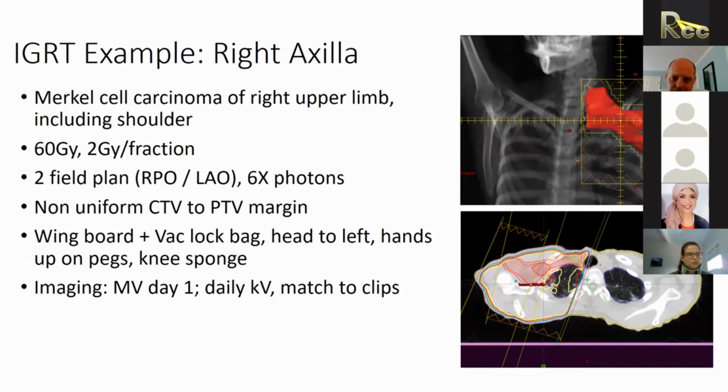Okay, well, this is the second time that you put the KV and the MV together, or portal image plus CBCT. I think you want to align by the portal image to make sure that the patient is anatomically in the same position as the simulation and avoid rotation, by aligning the bony landmarks first, then having your KV CBCT, particularly in the first treatment session.